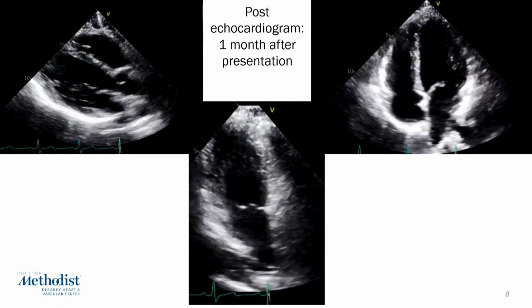Anish, let me ask you one question. You showed us that there was a modest elevation in cardiac enzymes, right? What was it, about 500 or so? Yes. And your upper limit of normal is 20. Okay. But how come you don't see any LGE?